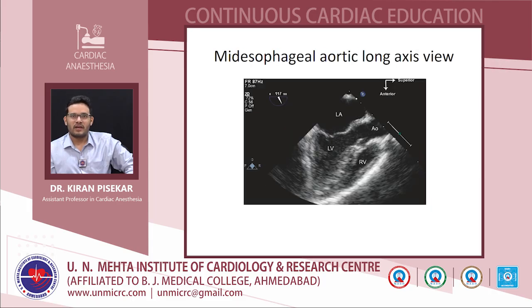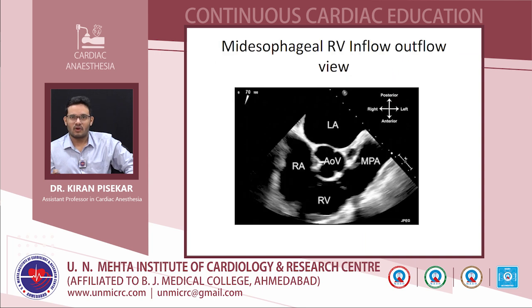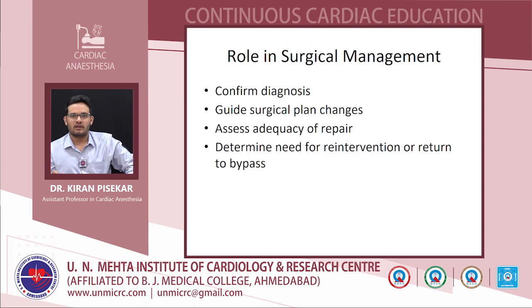Just by getting the different views, we are improving our image quality, and we are improving the diagnosis and confirmation. So we can use all the TEE views and confirm, and also get other findings like additional VSDs, etc.